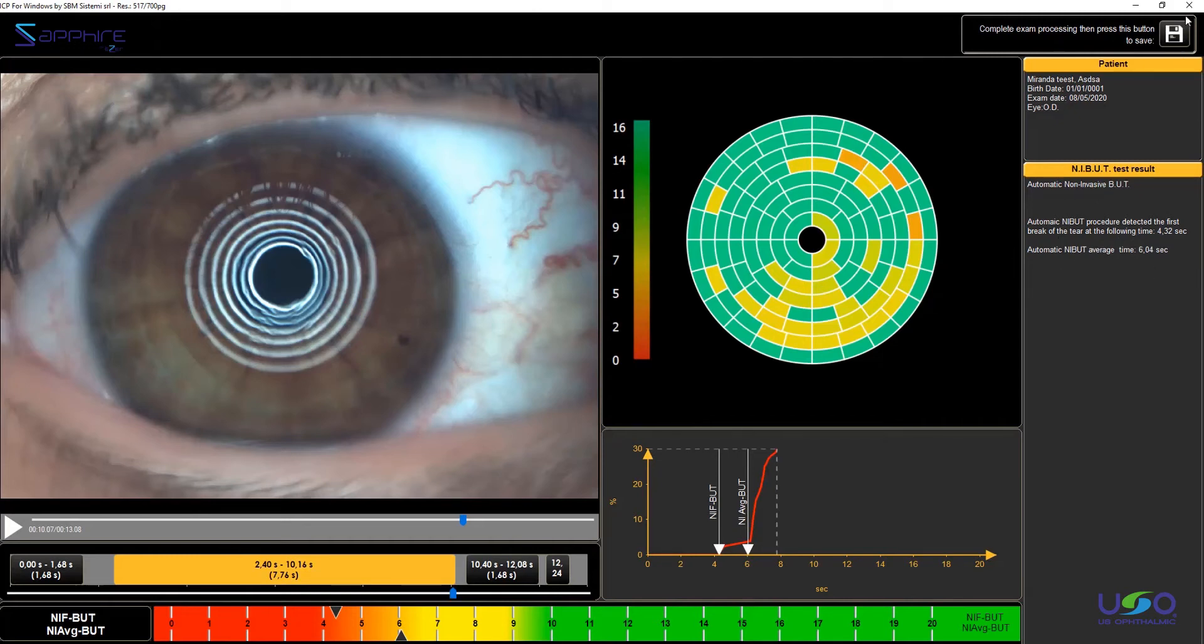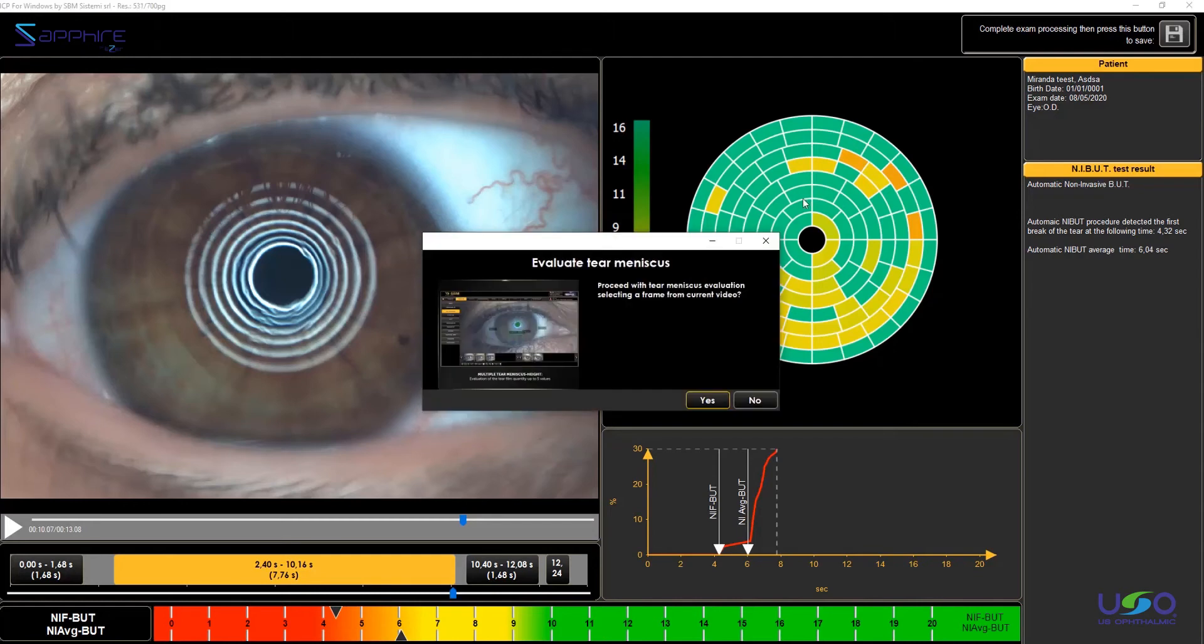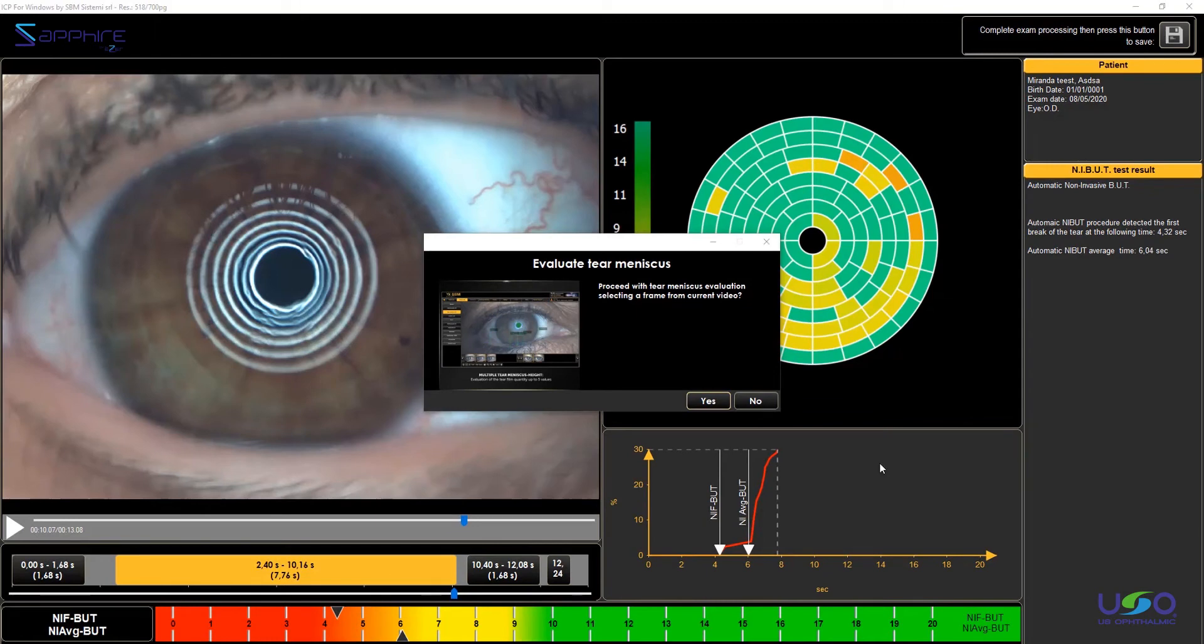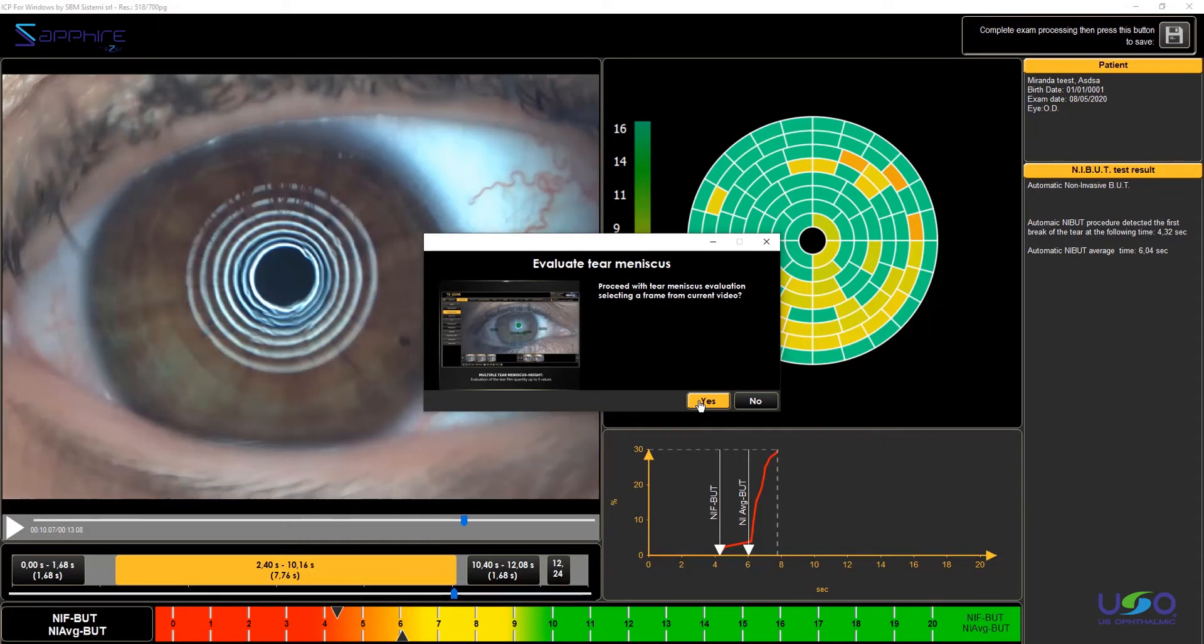So now we can save the value and automatically everything is going to be saved. On this video, the software is asking if I want to proceed with a tear meniscus evaluation. So now we can just press Yes to take a frame from the video and to make the analysis of the tear meniscus height.